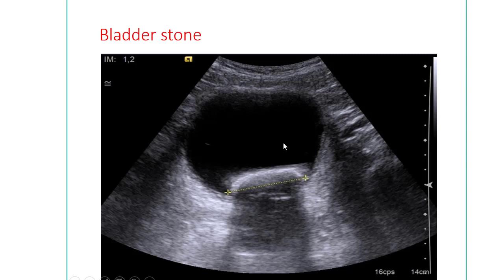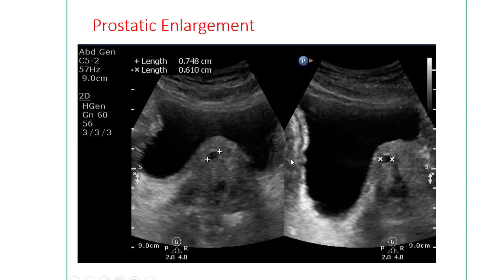This is prostatic enlargement, or benign prostatic hyperplasia (BPH), which can easily be identified by ultrasonography. The prostate is enlarged and protrudes into the bladder — this is called intravesical protrusion (IPP) — and this can easily be identified by ultrasonography.